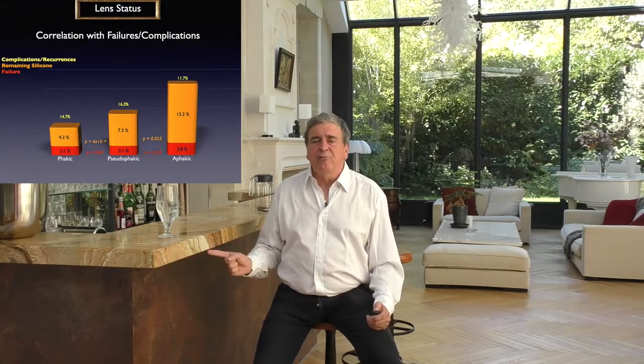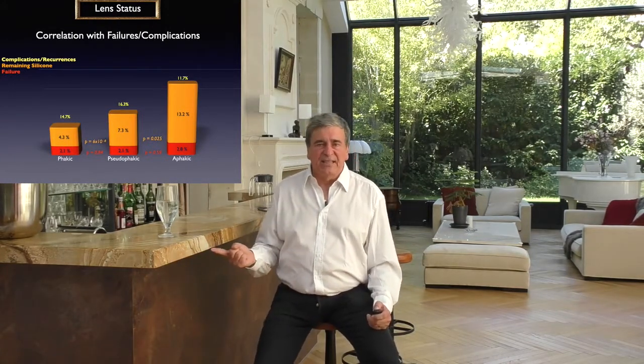So, here are the indications and contraindications of vitrectomy for me. You can see that my indentation technique, a little more sophisticated than the average, allows me to be a little more conservative. You can also see that at no time in the indications have I included the crystalline lens status. As the RD study reminds us, there is no difference between phakic and pseudophakic detachment.